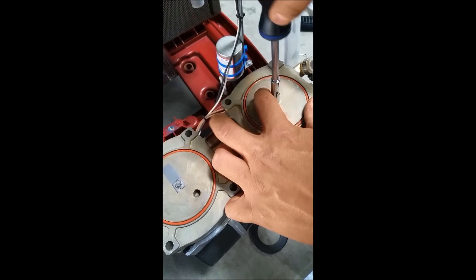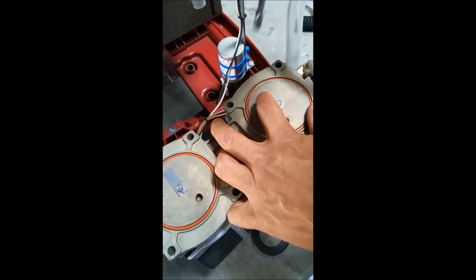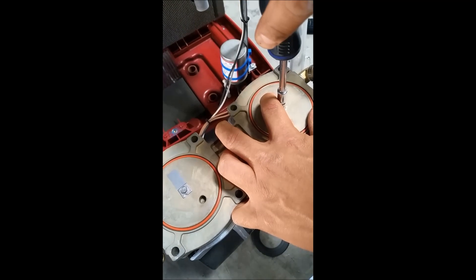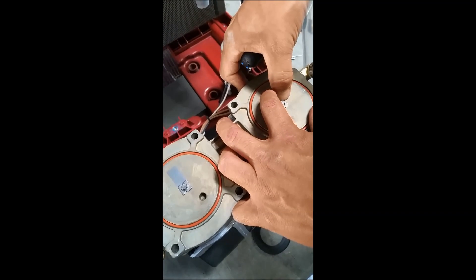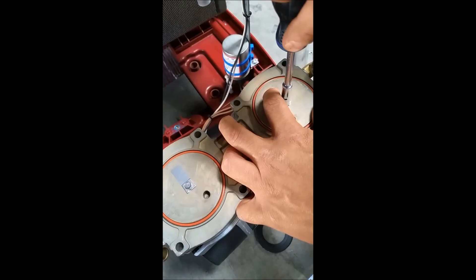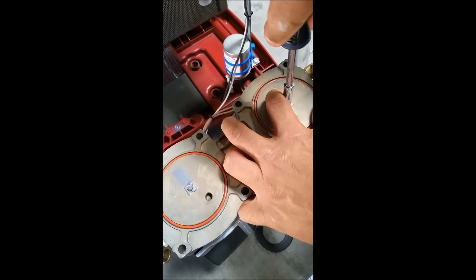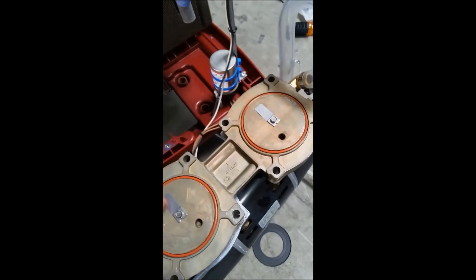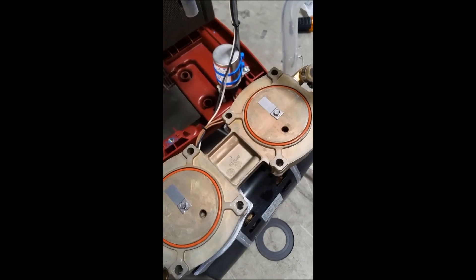We've got our second one on now and we're tightening. Continue to slide it over just a small amount while you tighten so that it's completely lined up. We're done — you can see the hole that was there before is now covered on both. The seals are now replaced.